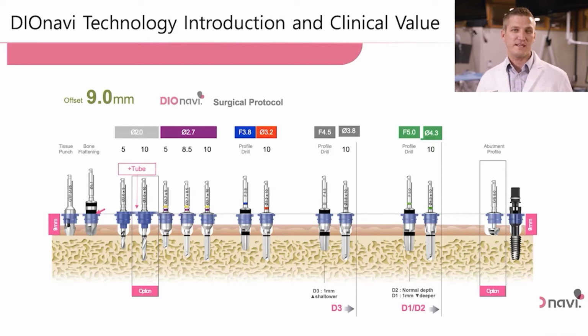Another thing I really like with DO Navi is their drilling protocols. They'll show up on a sheet just like this, and this sheet just makes it seamless and easy to understand what the protocol is. Not in words, but in pictures. Anyone can read it, anyone can understand it. It makes it even easier for me as a clinician to be there and to see exactly what the drilling protocol is going to look like.